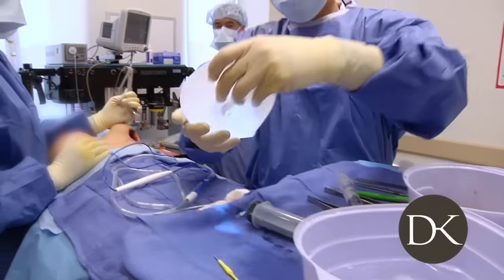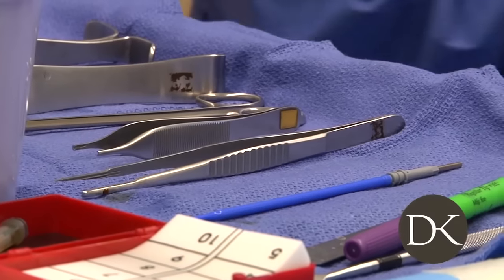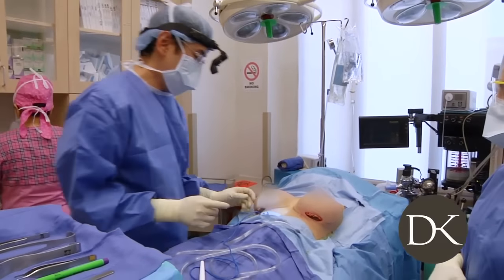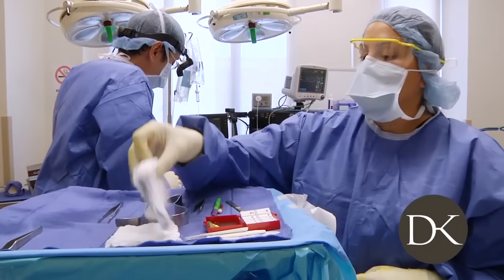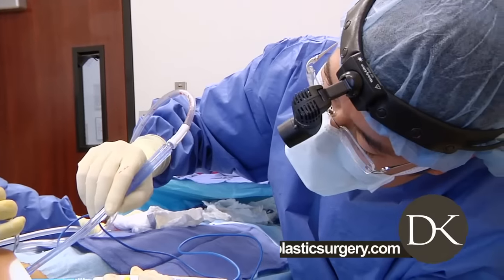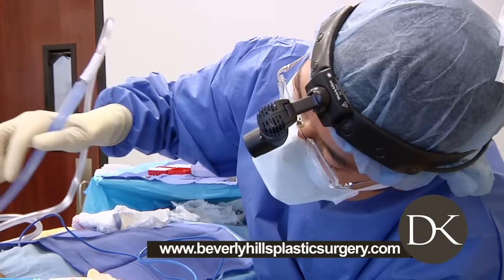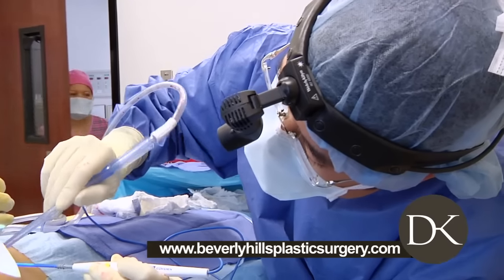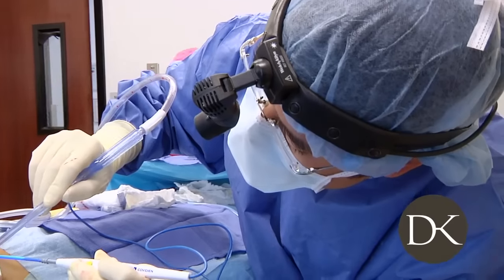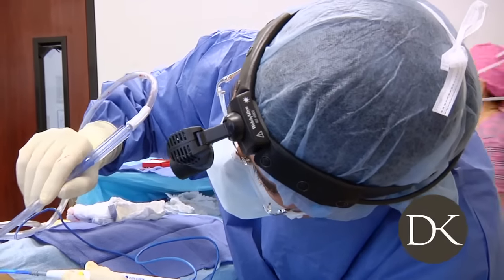So we took her to surgery, we did the inframammary incision. We were careful in this case not to make an overly large pocket. Using the sizers, we were able to determine that she'd get a 475cc implant, and they were lined up nice and straight. These implants are shaped, so the pocket has to be made to the size of the implant. Normally we kind of make an oversized pocket. But in this case, the pocket shouldn't be too big.